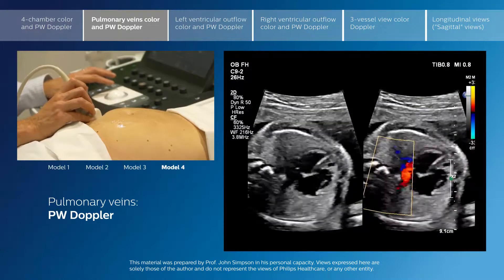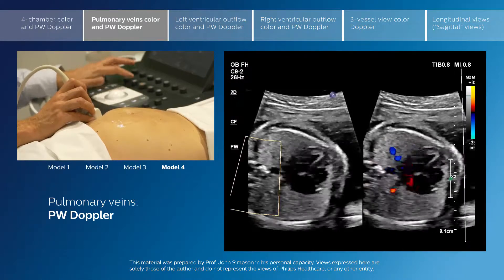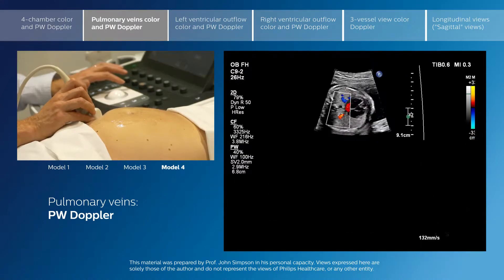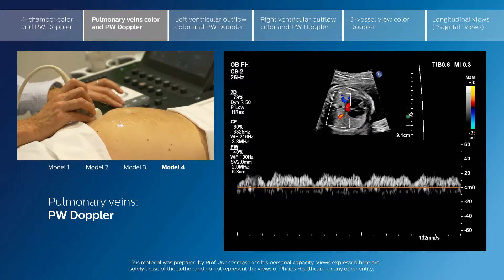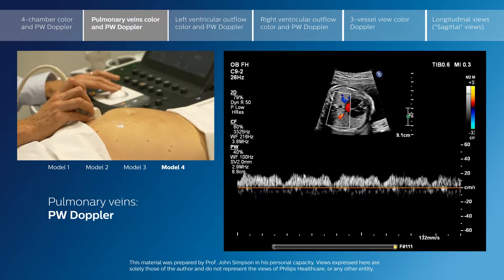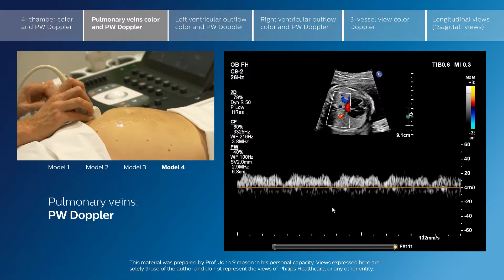Whilst we're in position here, we'll use pulse Doppler to interrogate the flow pattern through the pulmonary veins, picking the right pulmonary veins here. We can see very nicely the low velocity, phasic flow pattern through the pulmonary veins. This is ventricular systole, ventricular diastole, and this is atrial contraction, where the velocity is at its lowest. In some cardiac lesions, the flow may actually reverse with atrial contraction.